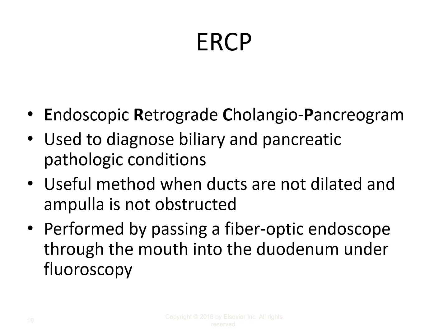Useful method when ducts are not dilated and ampulla is not obstructed. Okay. Sometimes it is difficult cannulating in this fashion when the common bile duct is very tortuous or there is a stenosis or obstruction at the ampulla. Okay. Sometimes that can be overcome, sometimes it can't. Okay.